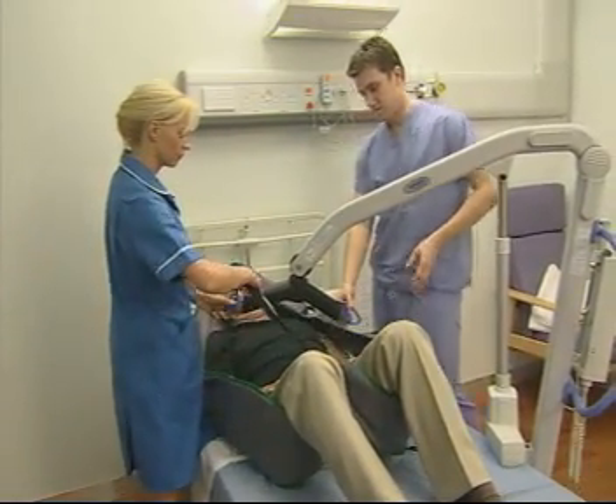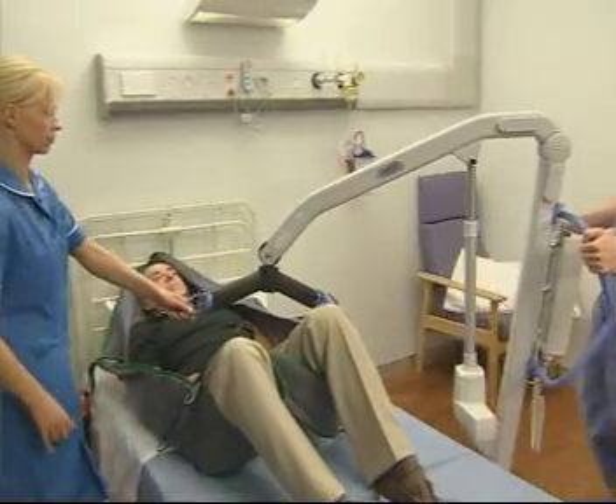Unhook the sling and move the lift right out of the way before removing the sling to complete the manoeuvre.